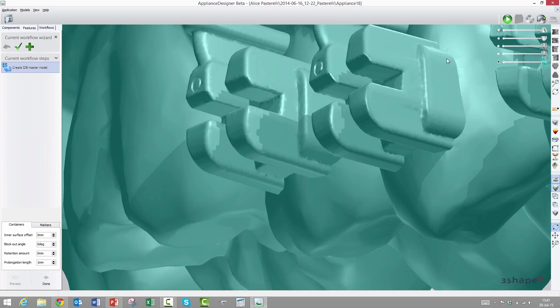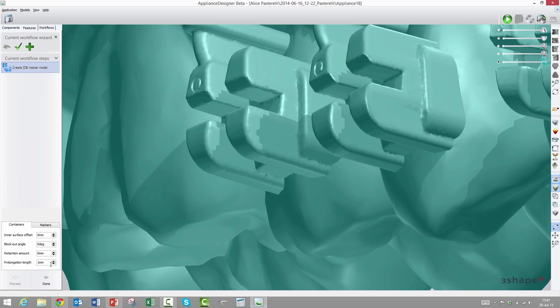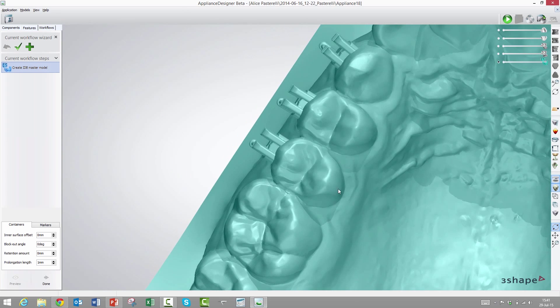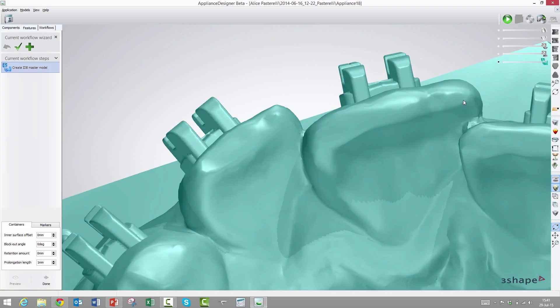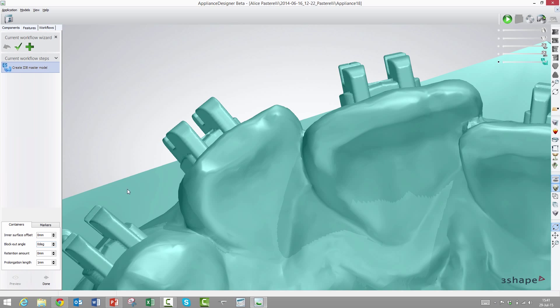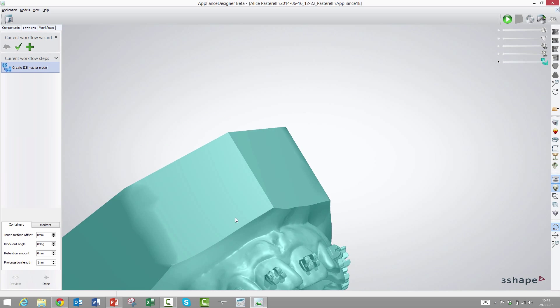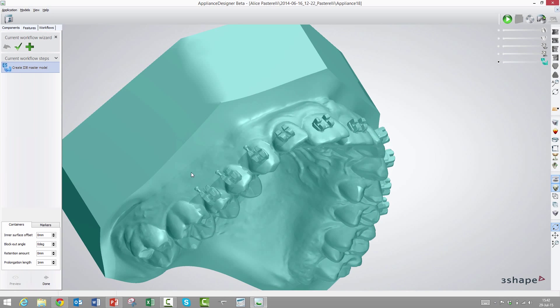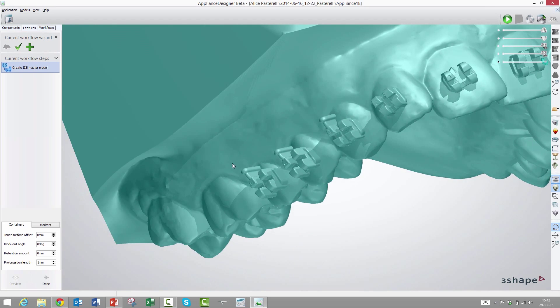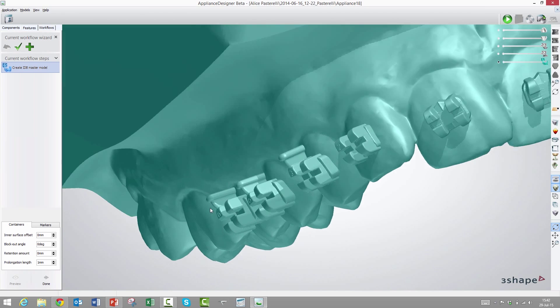The last parameter is called prolongation length. It takes care of any cavities that are under the bracket base and the tooth surface. Sometimes the bracket will rest on only three or four points on the tooth surface and there might be a little hole underneath. This prolongation length will extend the bracket base into the tooth according to this parameter. If we have a patient with very thinly worn incisors, maybe we need to reduce this to 0.5 millimeters.